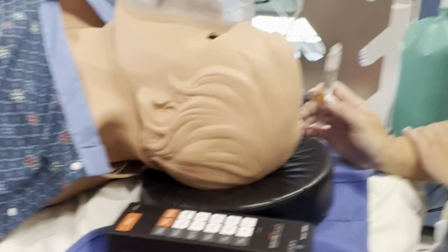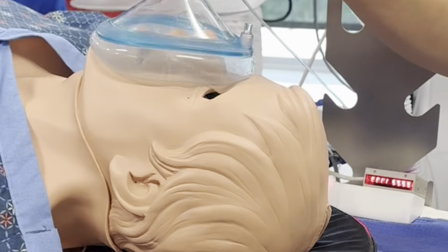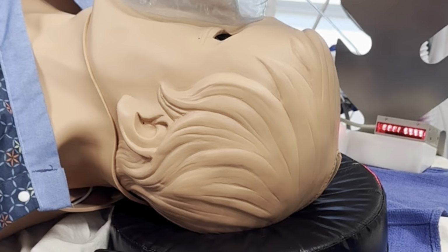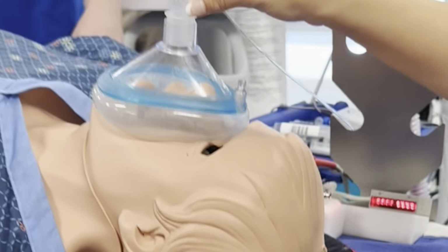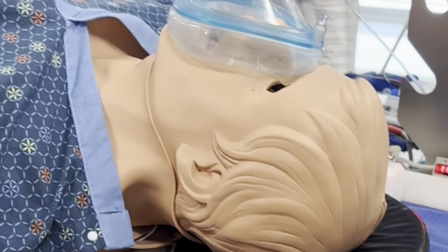So the first thing we're doing is pre-oxygenating, right? He's got that mask on. We've got oxygen over here on the machine. That's that green line, that green dial there. Also in this operating room, if we had to, in an emergency situation, we could do surgery in this room.